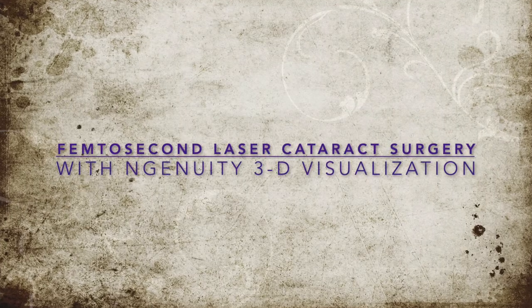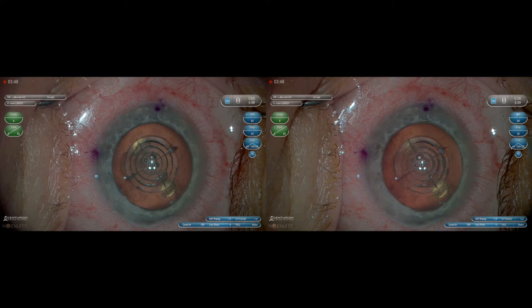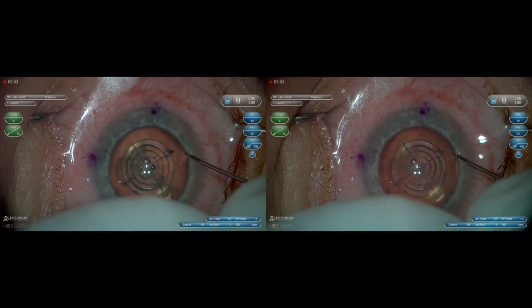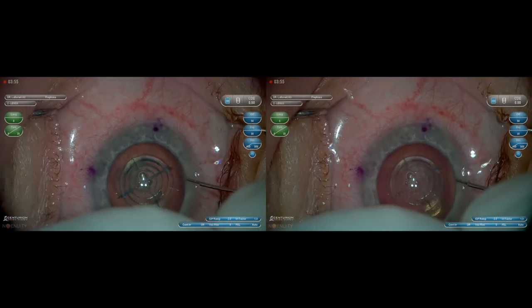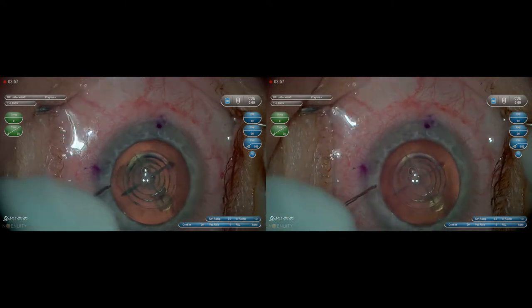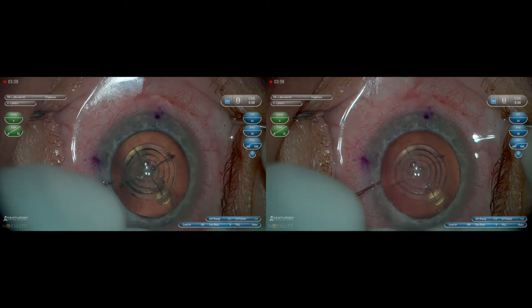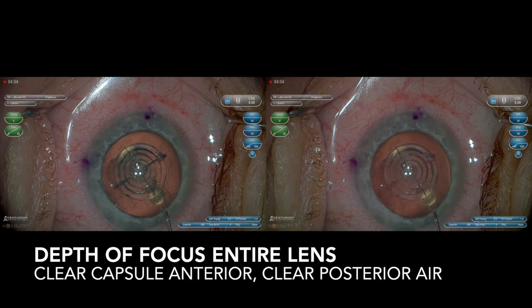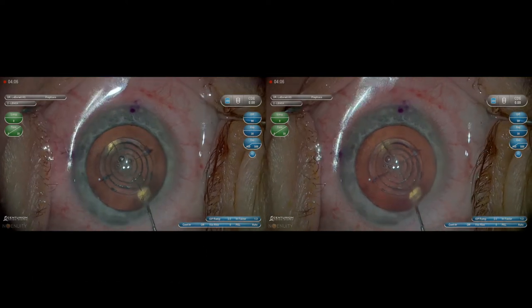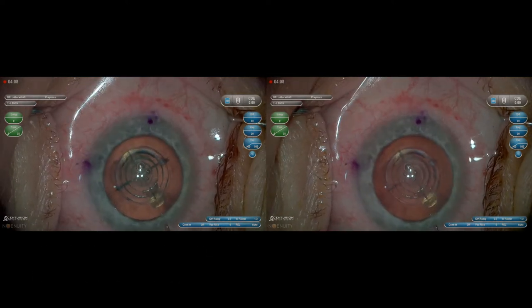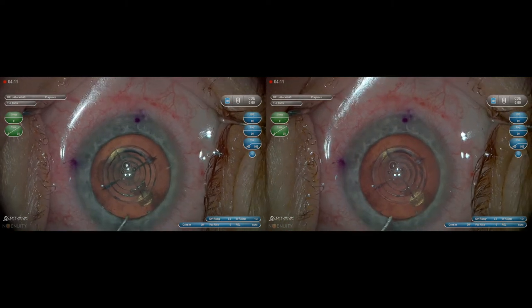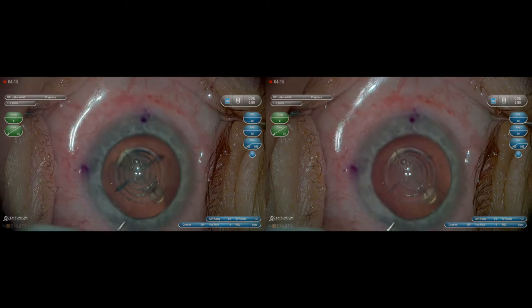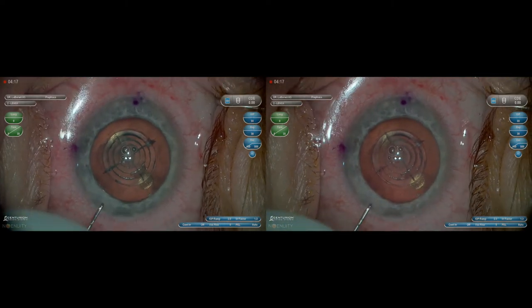This is the overall setup of the OR. This is a case where I'm using the femtosecond laser in combination with the 3D Ingenuity. I'm opening the AKs to reduce the astigmatism. As I'm working in the cornea, you can see the entire depth of focus of the lens — so I'm not constantly zooming in or out or refocusing in different areas.